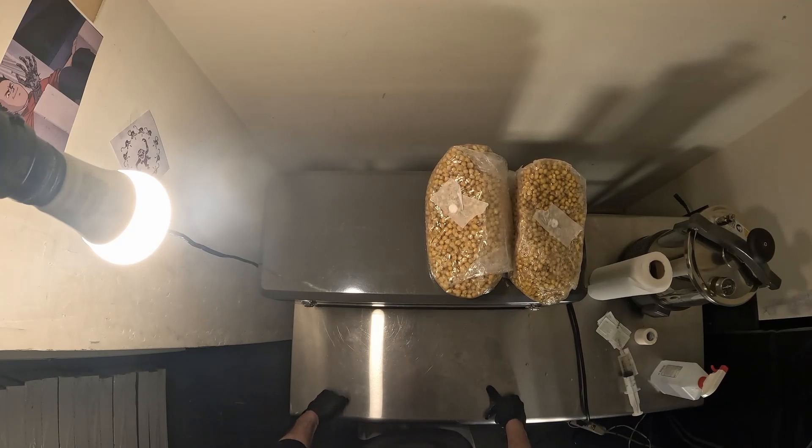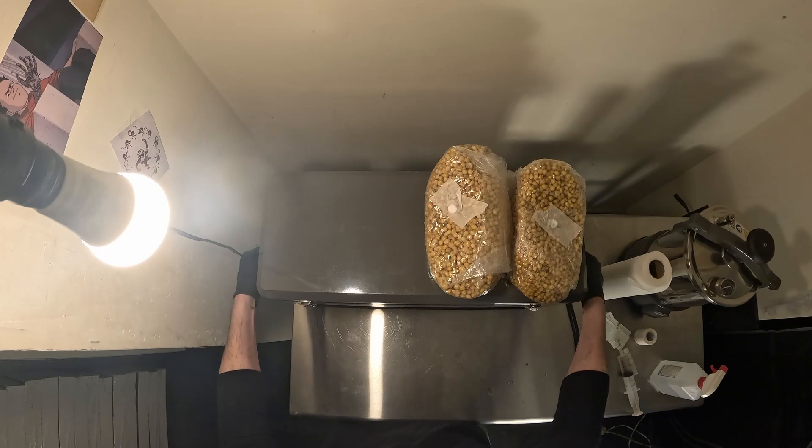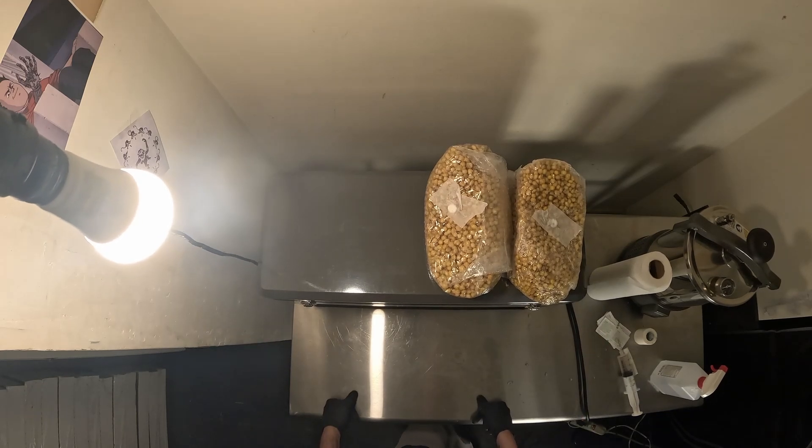It was definitely worth the money for me — I know it's not cheap, but it has handles so it's not too bad to move around. For me it's dual purpose: I can use it for growing mushrooms as well as for tissue culture of cannabis plants.